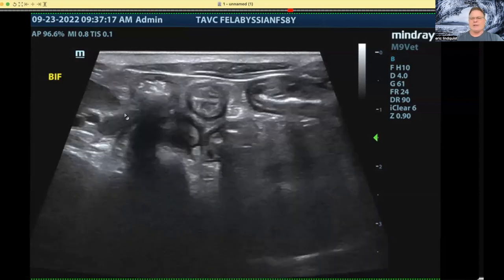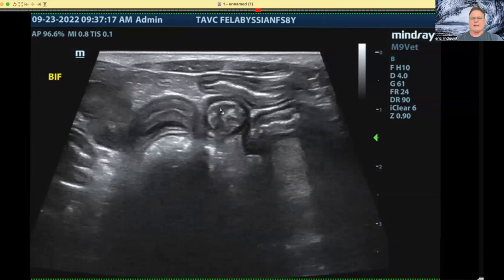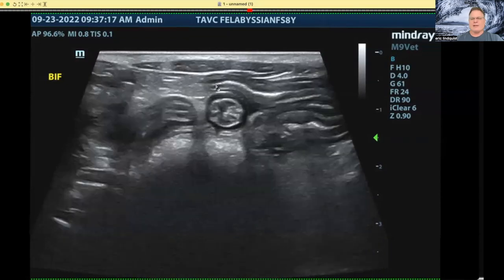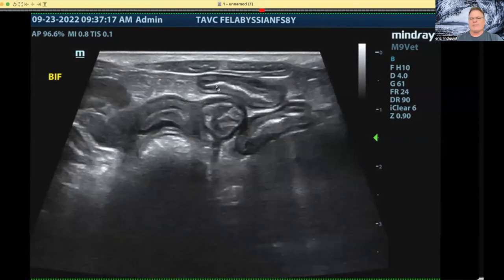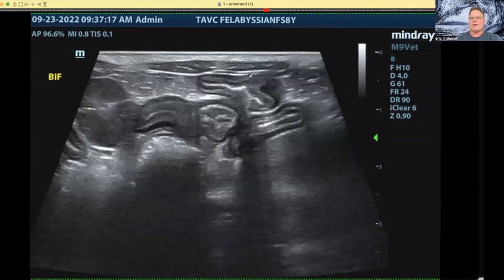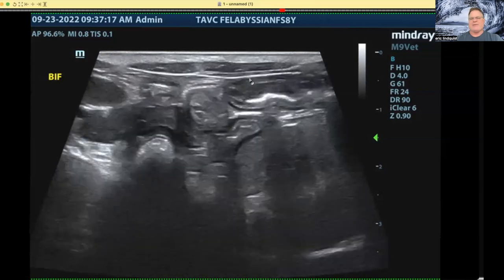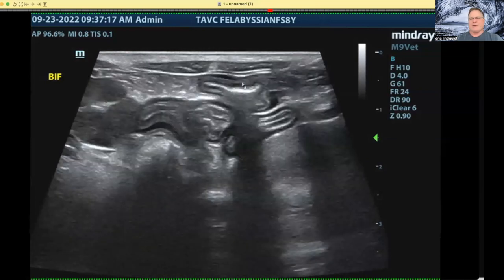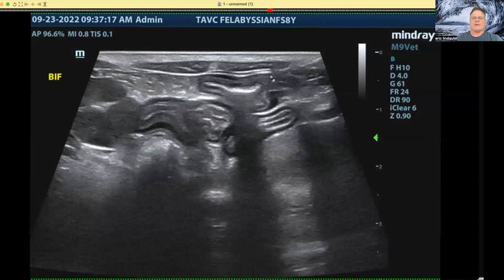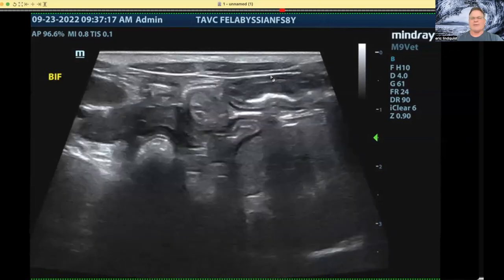It's very important that you run the whole bowel with high resolution so you can make out the layers adequately and make sure there's no neoplastic criteria. If you do find neoplastic criteria, do intraoperative ultrasound and find the area where you have mural detail loss — where the muscularis and submucosa show detail loss in the wall — that's the area you want to sample or resect. Hopefully these quick tips help. Hope you're enjoying Sona Minutes. Always come to saunopath.com — we're always here for you.